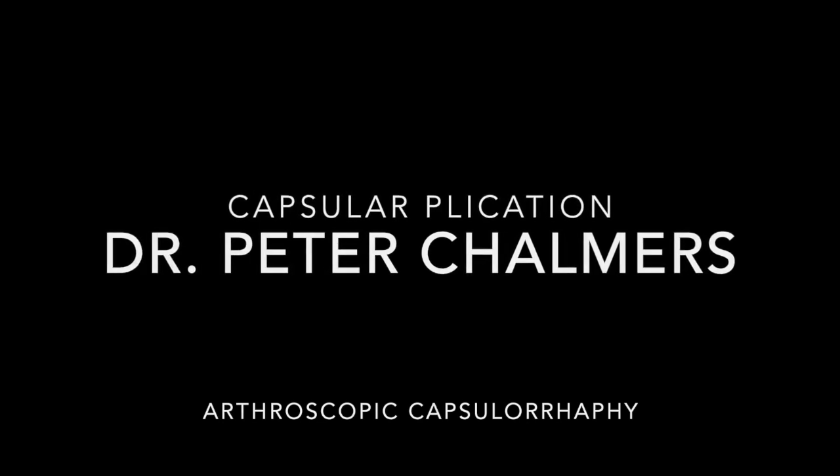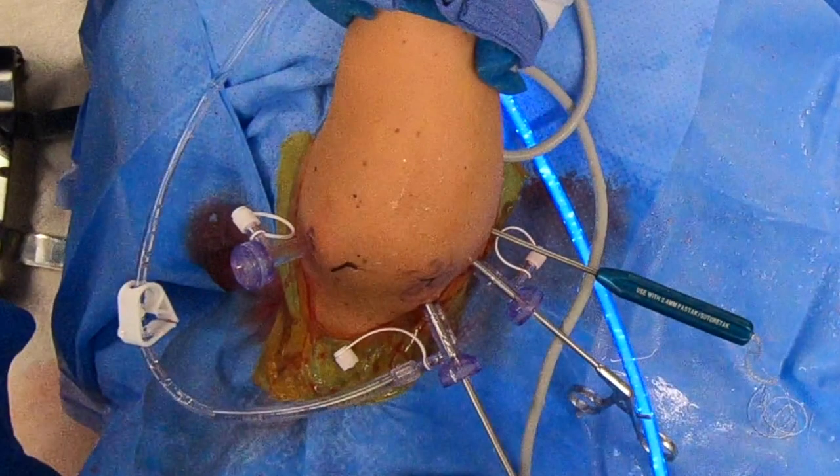This procedure is performed in the lateral decubitus position. You can watch my video on Bankart repair to see exactly how to place all these portals, but I have posterior, anterosuperior, and anteroinferior portals, and then a 5 o'clock percutaneous placement for anchor insertion.